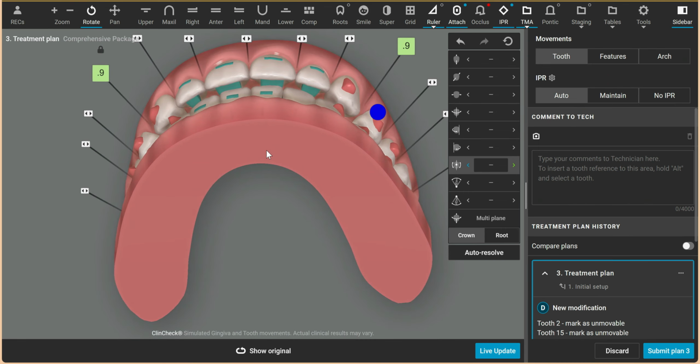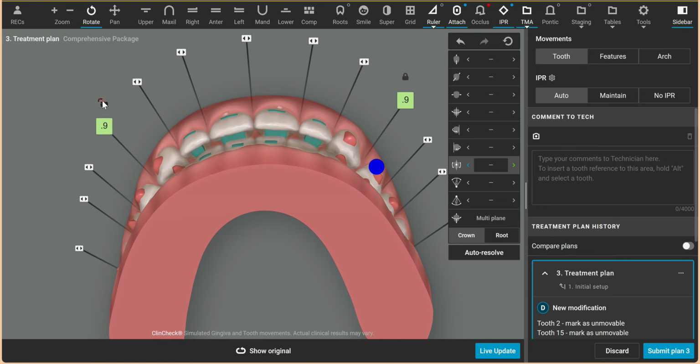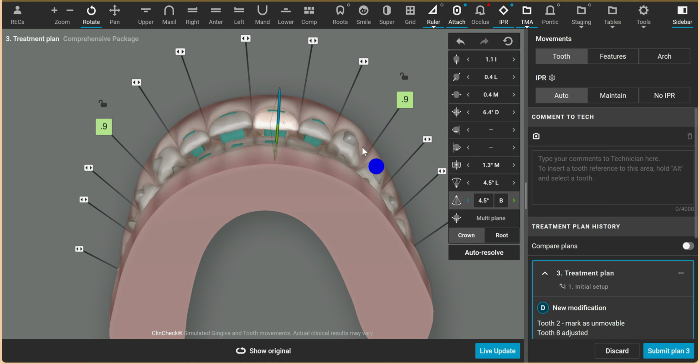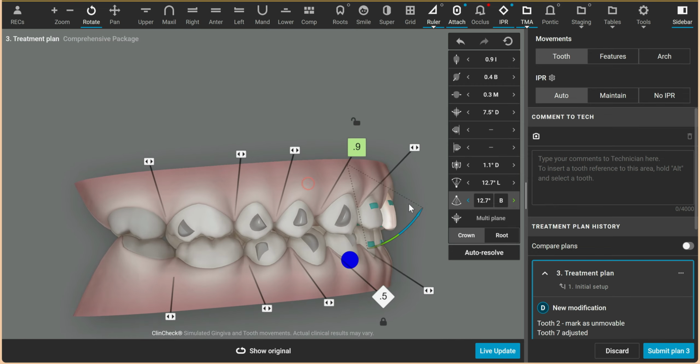What else can you do to get a little more bite relief? Well, if you unlock this space right here, you can use labial crown tip, and you can actually procline the incisor teeth a little more. They're really retroclined, and there's lingual inclination to begin with. Just kind of work with this a little bit. That's torque. This is the one right here that you want. And you can actually create a better inclination.